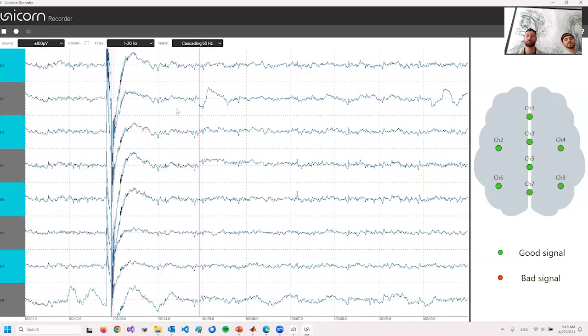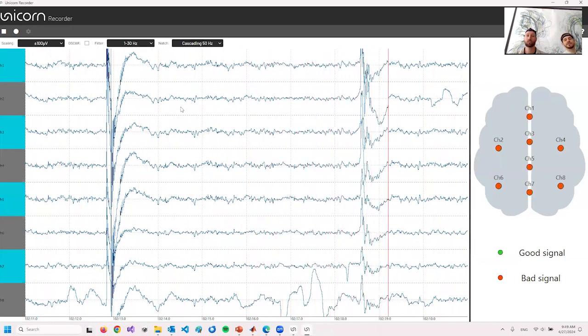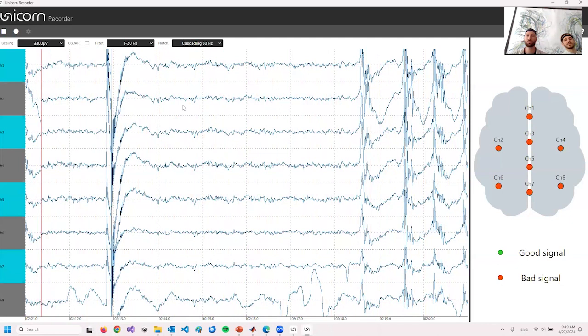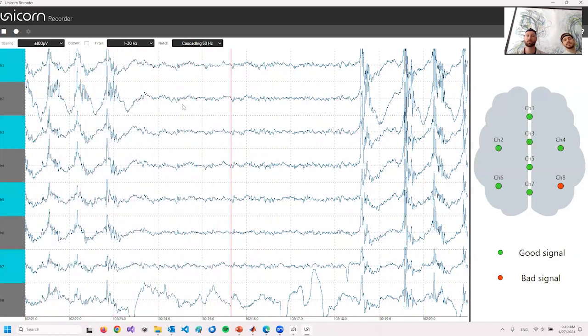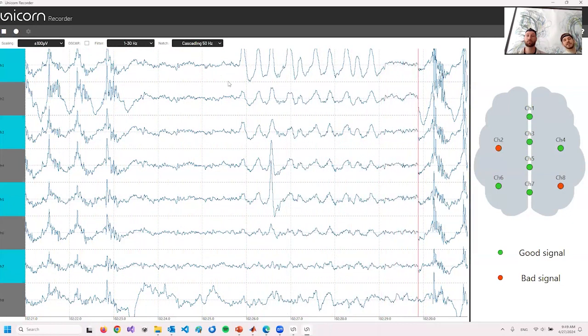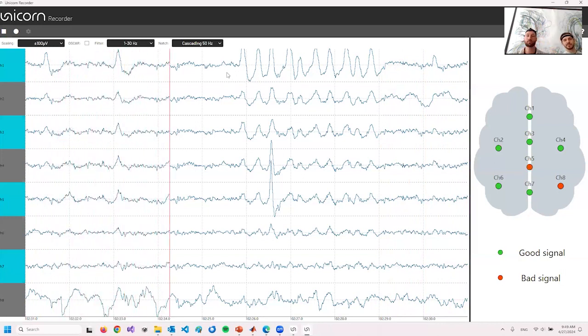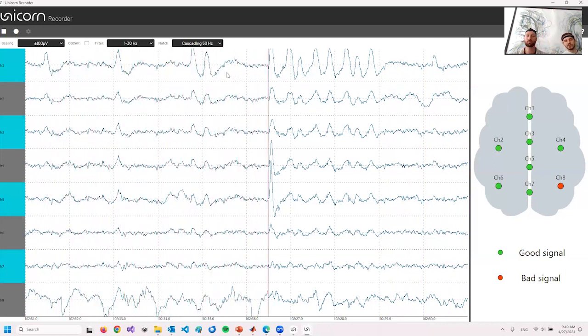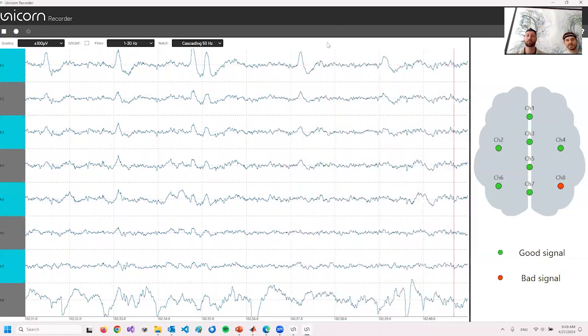And now we can make some tests again. So Leo, can you clench your teeth a couple of times? Now we can see teeth clenches. Can you blink a couple of times? Now we can see some eye blinks, especially on the channels close to the eyes, on the forehead. The first channel has the biggest amplitude, and that's an artifact. We usually don't want to have that in our EEG.